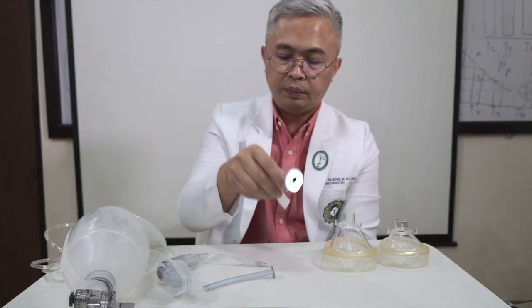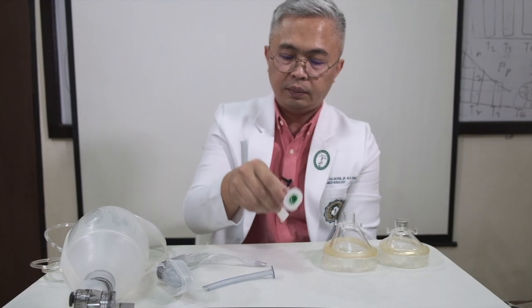It's worth mentioning the advantage of using a nasopharyngeal airway. You can use it even in an awake patient because it's more comfortable, but the disadvantage is you can traumatize the nasal passages and cause bleeding. The advantage of the oral airway is that it's more available and easy to insert. The disadvantage is that when you insert it in a lightly sedated patient, there's potential for stimulation of the gag reflex and potential for the patient to vomit and cause problems later on.